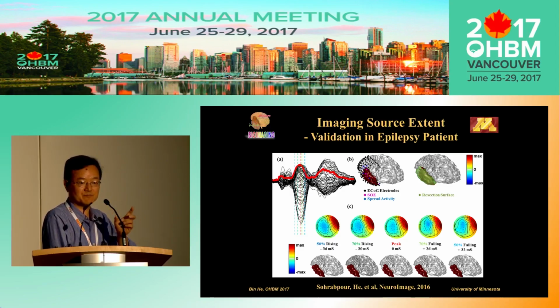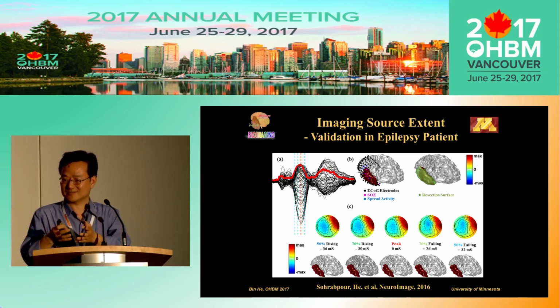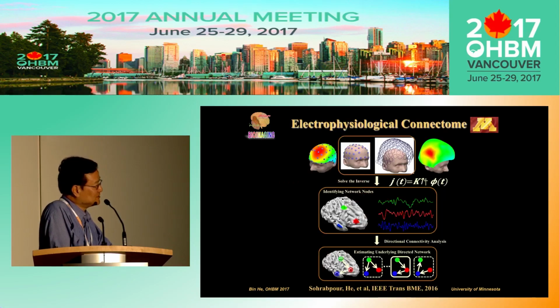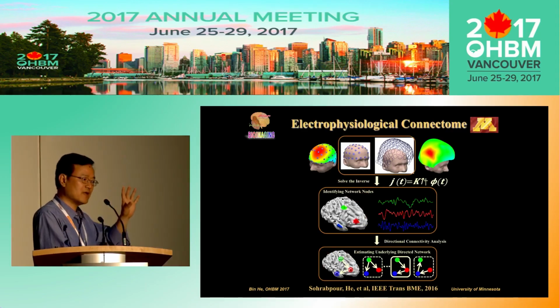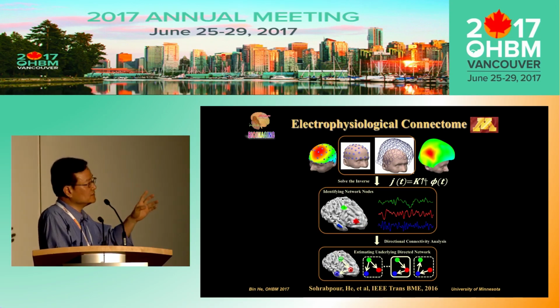And this will be very important. If we establish this modality, it could make our EEG and MEG modality much closer to other neuroimaging modalities that many, many other people are using. So now I know that many other distinguished speakers are going to talk about connectivity. I want to mention what kind of challenges or key issues there are when you deal with that.